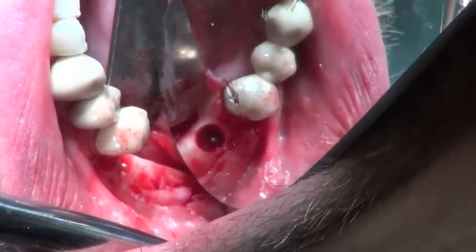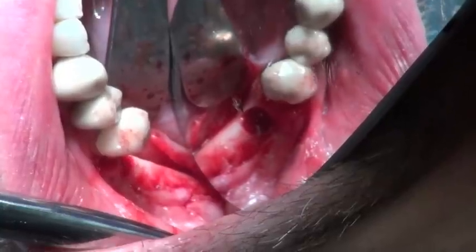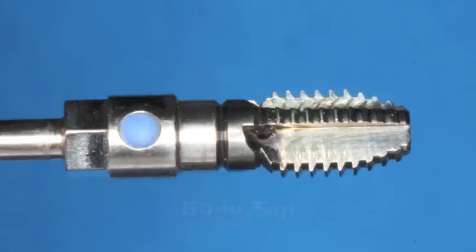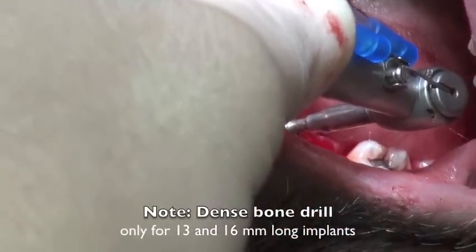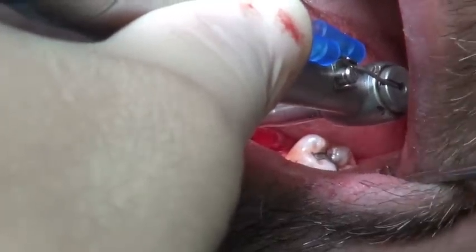We're getting close to my favorite part, which is putting the implant in. The osteotomy is 5mm wide by 11.5mm deep because it's 1.5mm longer than the implant. We're going to tap this just because the bone feels a little bit dense. The dense bone drill doesn't start until 13mm long, so we use a bone tap here and make sure the implant is going to go in and get to 45 Newtons. Almost always you get that great stability with this implant system unless the bone quality is not very good.